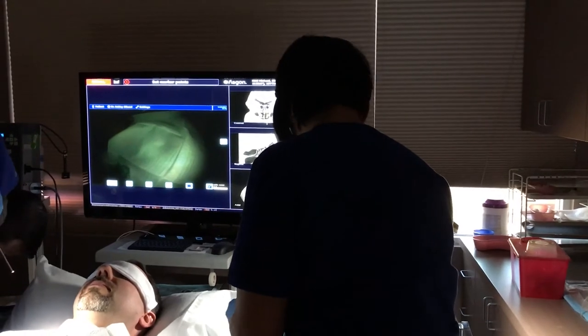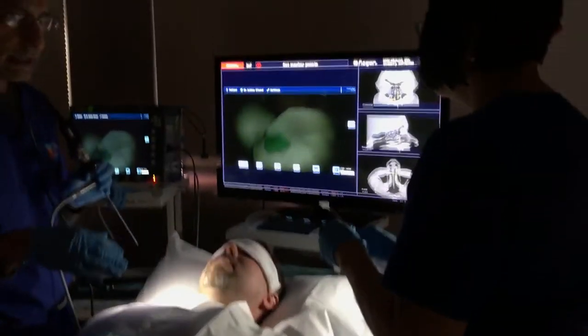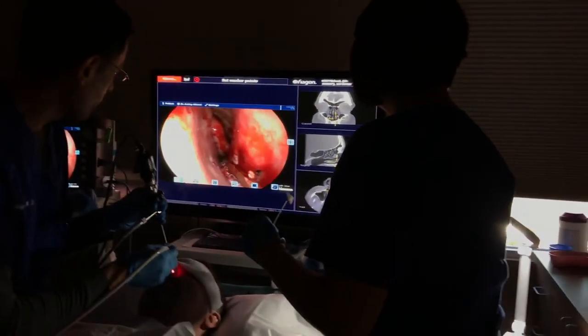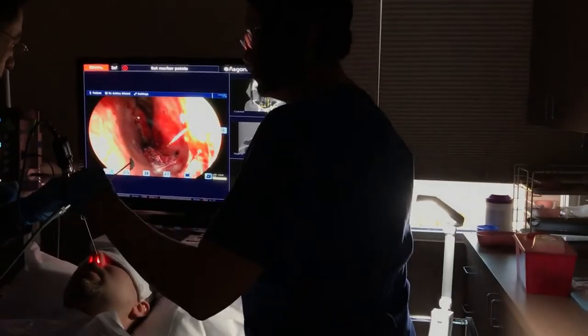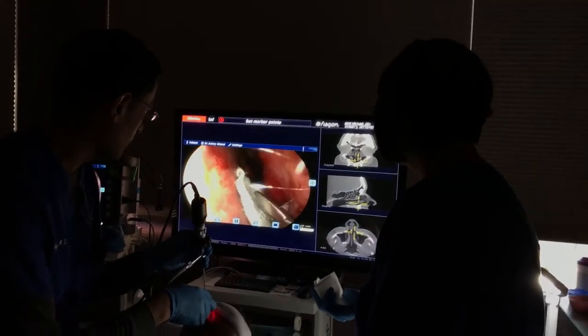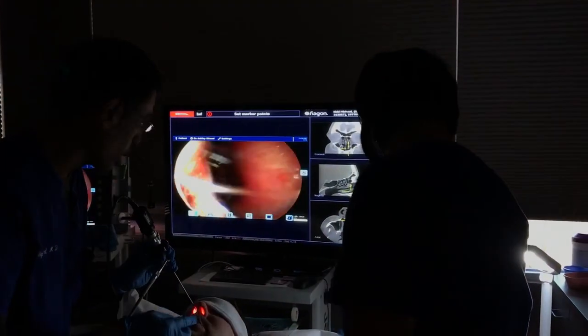Do you have the shaver here? Yes. With the last part — I've already done all the ballooning and everything — the last part is reducing the size of those little turbinates here. We do that with a device called a microdebrider — we call it a shaver. It's going to go underneath the lining of that turbinate and do that work.